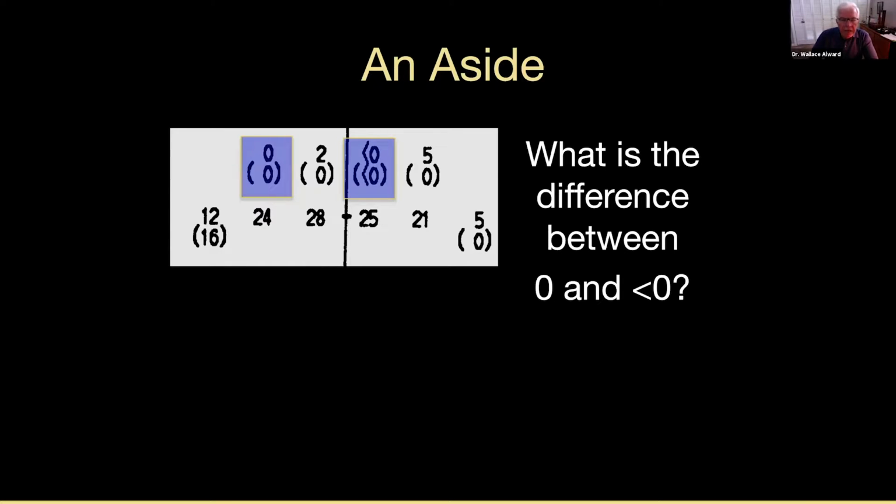Just as an aside, what's the difference between 0 and less than 0? And that comes back to knowing what these numbers mean, right? So this is decibels, as 28 is decibels of attenuation. So that means that you have this 10,000 apostilb light, that's the brightness of the target light in the Humphrey perimeter, and you can attenuate that light.